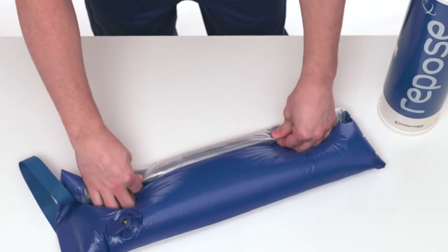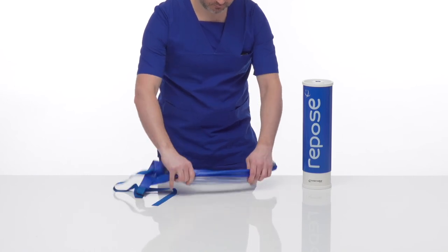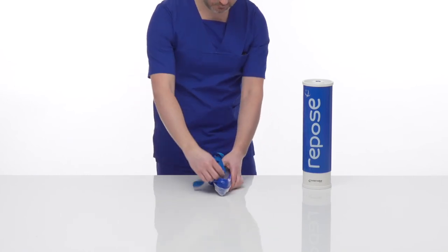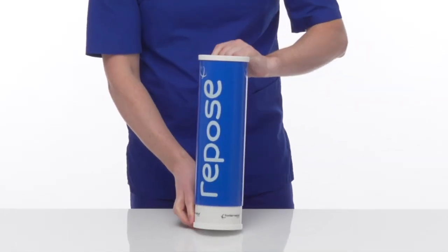Repeat this process as necessary. Fold and roll up and place inside the pump for safe storage. Rotate the outer tube until it clicks closed.